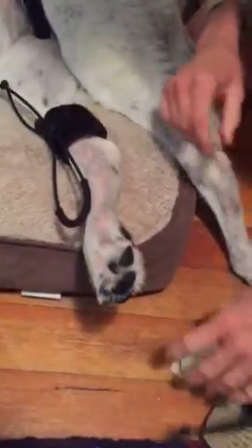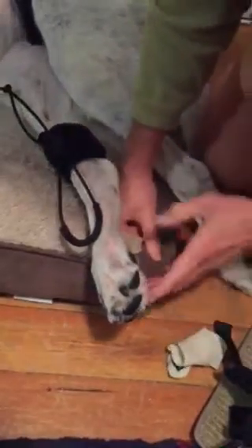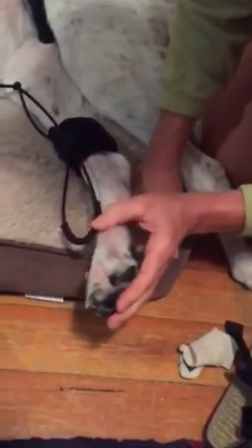To get her toes in there, I kind of gently push her toe pads and then pull this down at the same time. I don't crank these up, I just kind of hold them — it's two moves — then you slide it in, make sure both of those outside toes are there, and then that's ready to go.